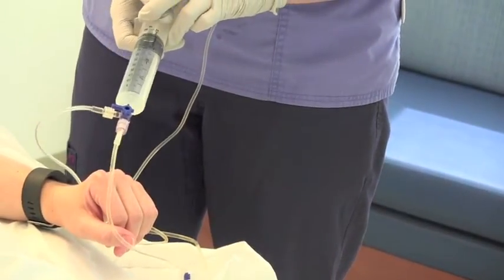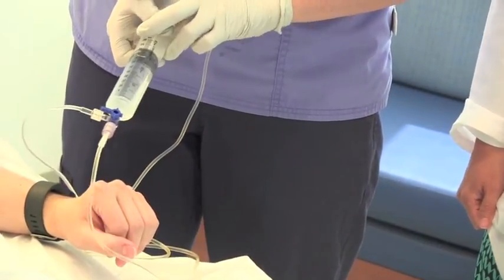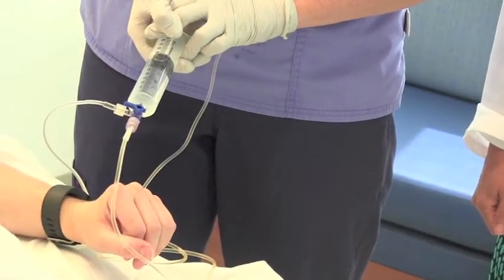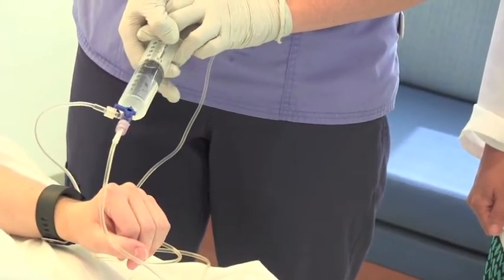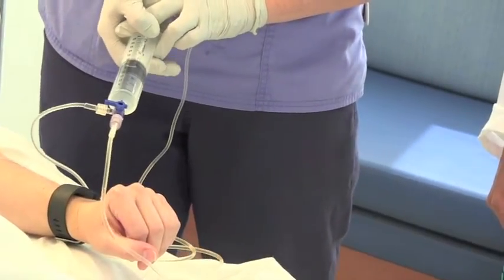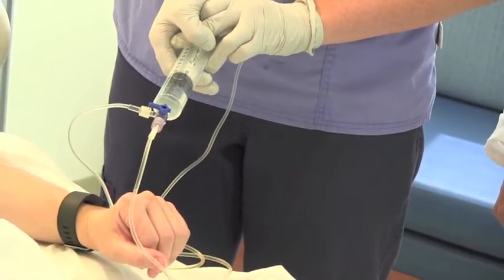And ideally you can get a 500 cc bag of the isotonic IV fluids in the patient within 5 minutes and a liter of the isotonic IV fluids within 10 minutes, making this the fastest method of fluid resuscitation for patients who are in urgent situations.